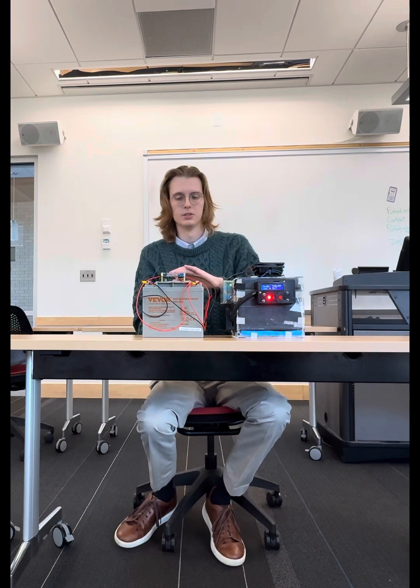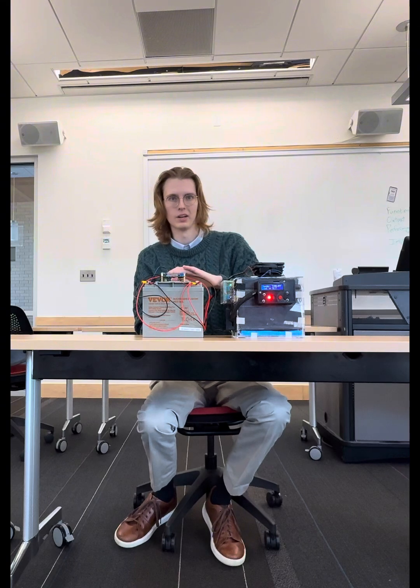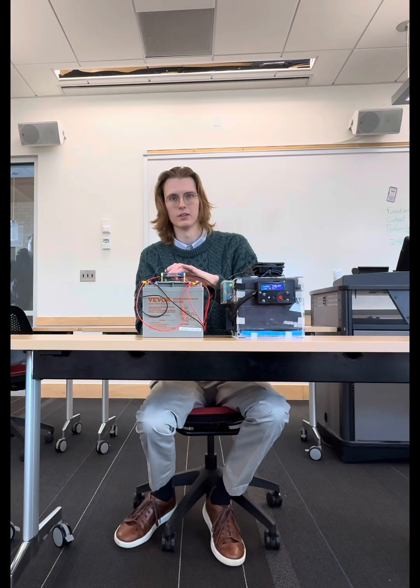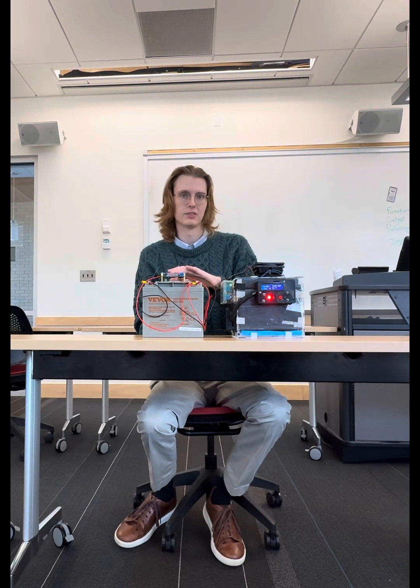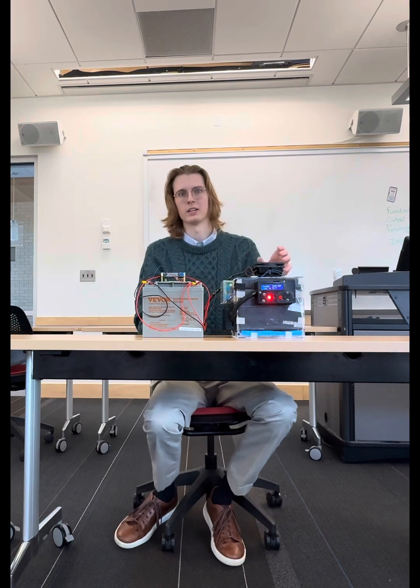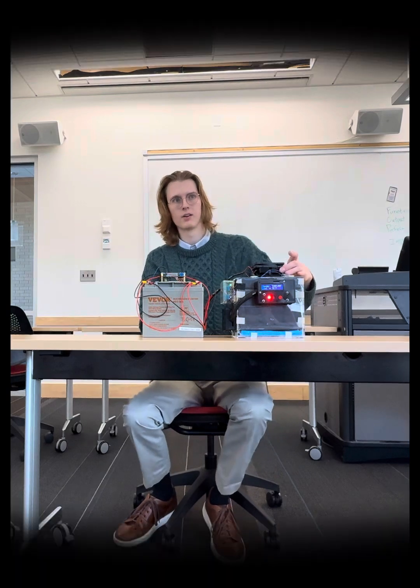Unfortunately, just due to the limitations of our budget, we weren't able to get a better transformer that could get the voltage and amperage that we need. So we're not operating at the optimal temperatures. With these settings, we get a temperature differential of 40 degrees Celsius, but if we were able to get the right settings, we could get a temperature differential of 80 degrees Celsius outlined in sheets in our data. Next, we will talk about the circuitry of our Peltier device.